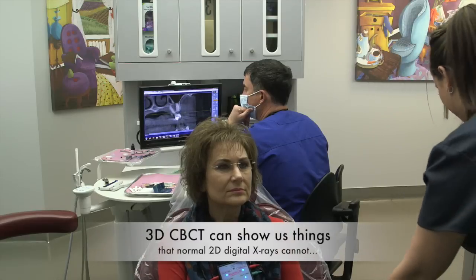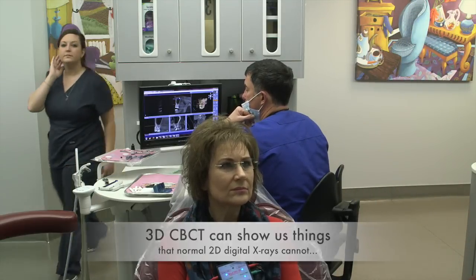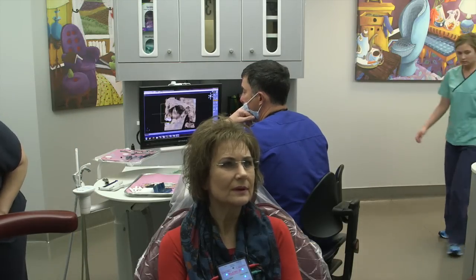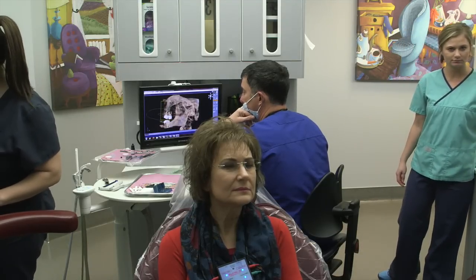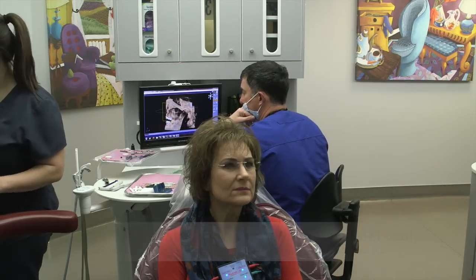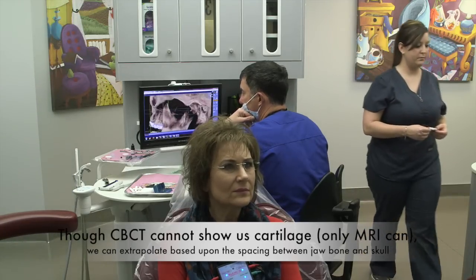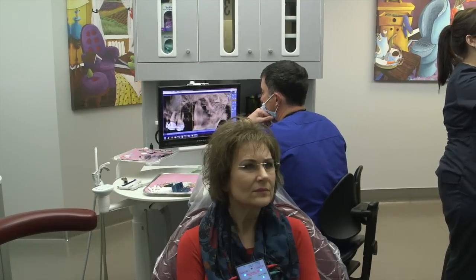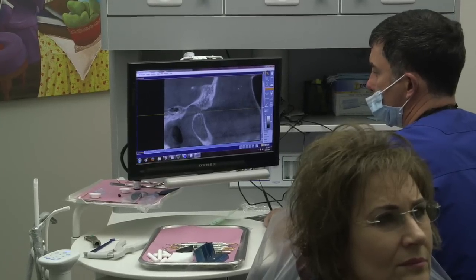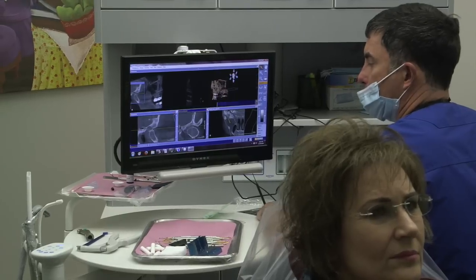The root tips look healthy on your upper left. Sometimes we'll find an abscessed tooth or something weird that's causing strange pains. You don't have any of that. See here — you can really see what's going on. There's your ear canal, your spine, your skull up here, cheekbone — the zygoma. There's the space between skull bone and jawbone; see there's a little space there. That's where your disc is going to be laying. So your left side looks pretty good, totally normal, just a little bit thicker than the other side.